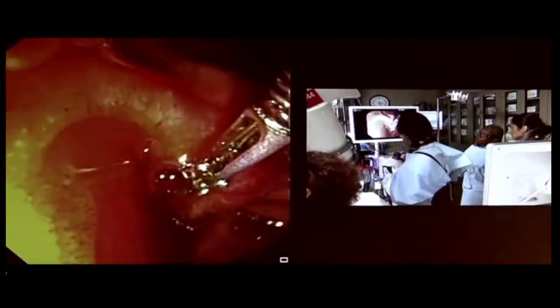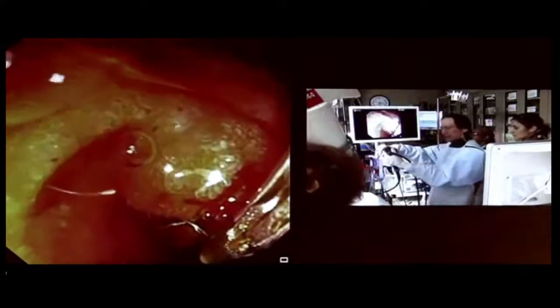See if we can orient the rat tooth a little bit so that we can just get the basket handle. So you can see the handle there, slowly close. I'm intentionally not pushing too far forward. Keep closing. This is a very large rat tooth, but I think I've got it now. And the assistant's going to hold this firmly. Now remember, it's a bit ingrown. It's a fully covered stent, correct? So it should come out, but what I'm going to do now is lock here.